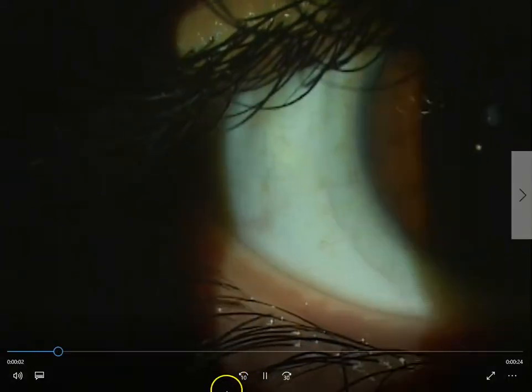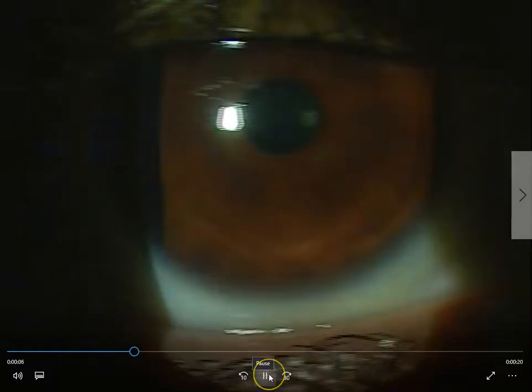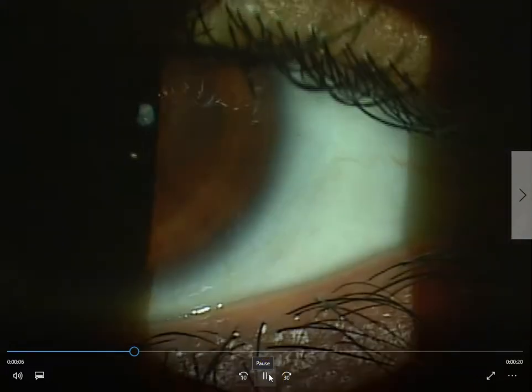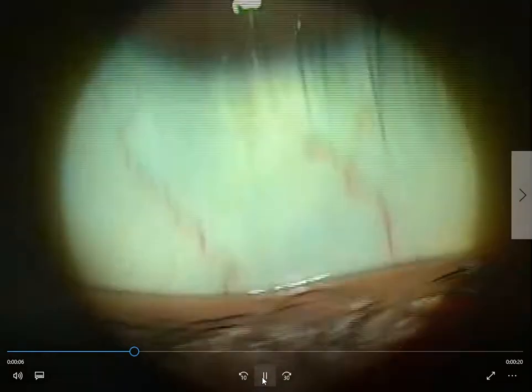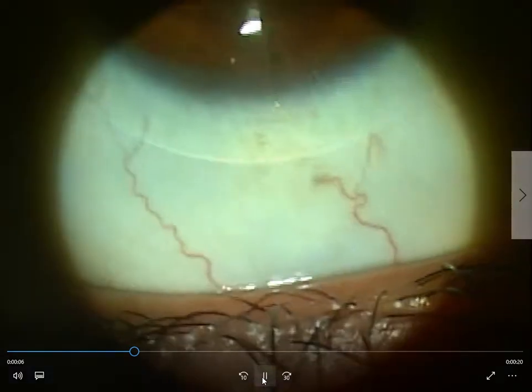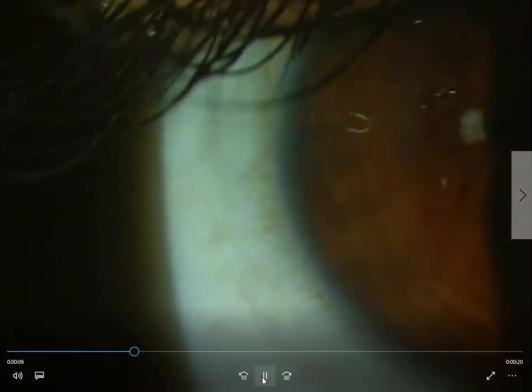That's how we evaluate the centration and fitting of contact lenses in our office. You'll now see the video at a slightly faster speed. You can see the orientation mark and the excellent movement on that contact lens, as well as the centration from one side to the other, and the axis mark.